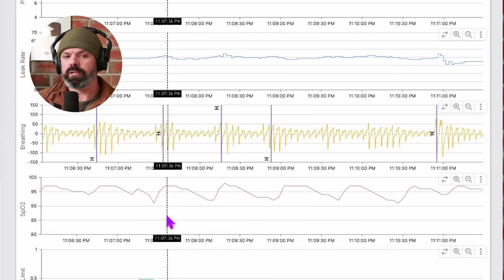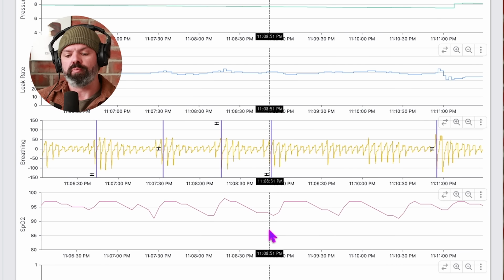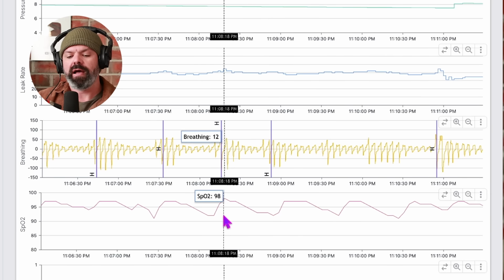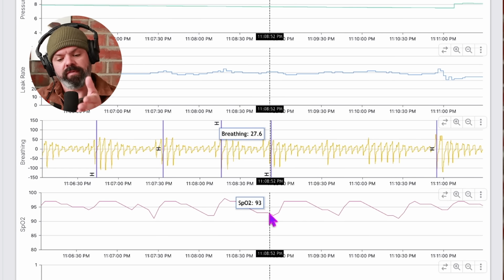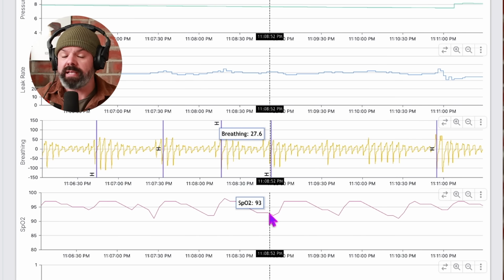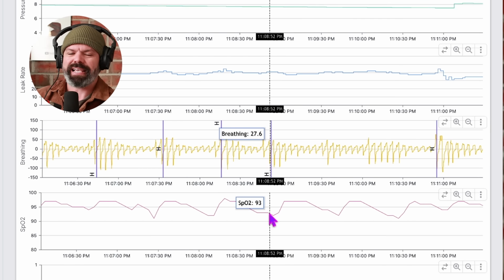But what I want to show you is this. It's crystal clear that this is sleep disordered breathing. Yeah, very irregular. We've got the hypopnea flags marked here, blood oxygen dropping in response to that shallow breathing. And the machine knows this, eh? It's flagging the events. It knows there's sleep apnea there. And what you would expect from his AirSense 10 automatic is for the pressure to increase to treat the sleep apnea. That's how it works, all right?